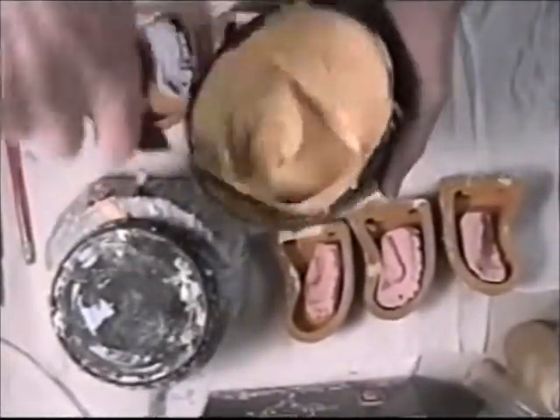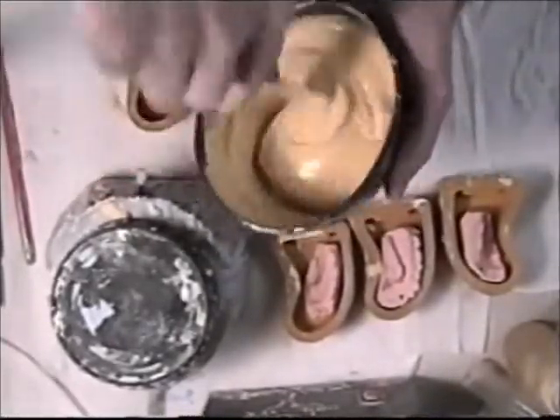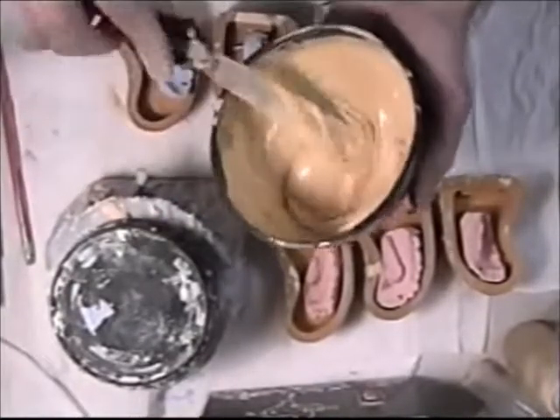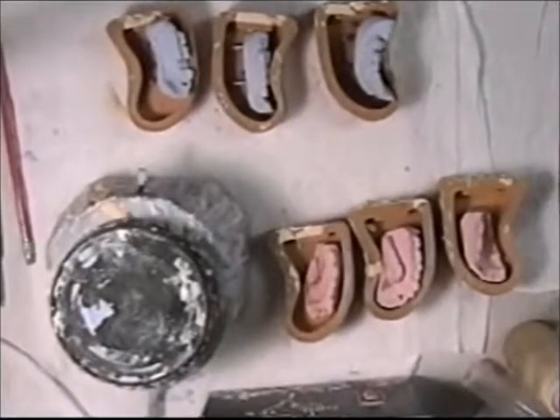I'm mixing up my lab stone and I'm going to be pouring this stone into the rubber molds here. This will be our bases for our models.